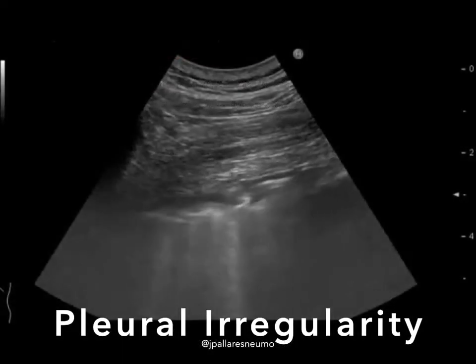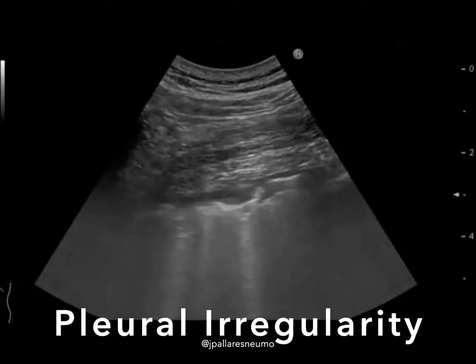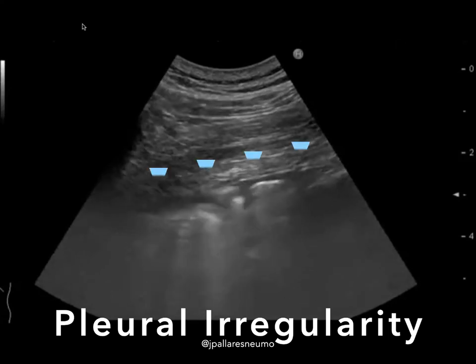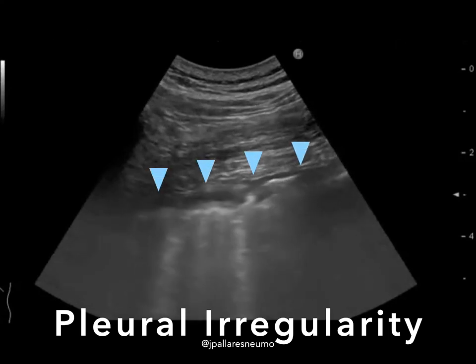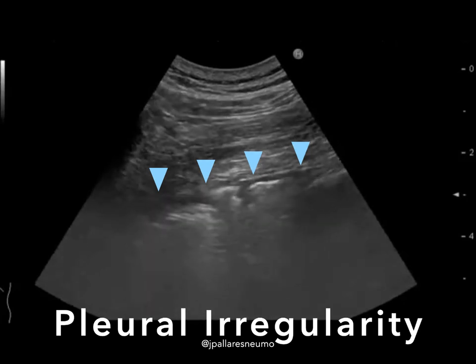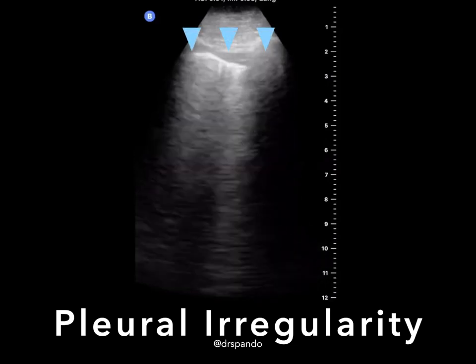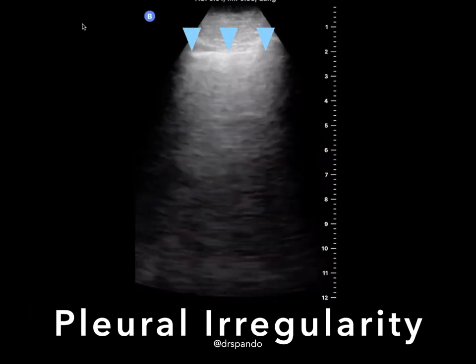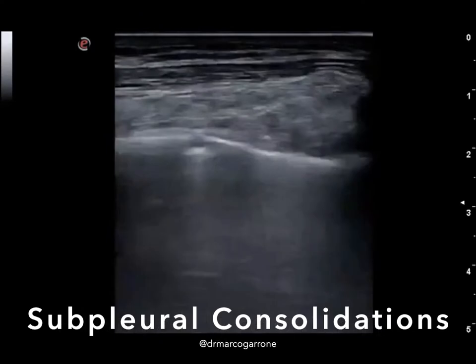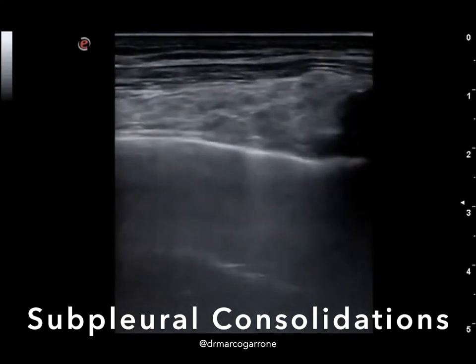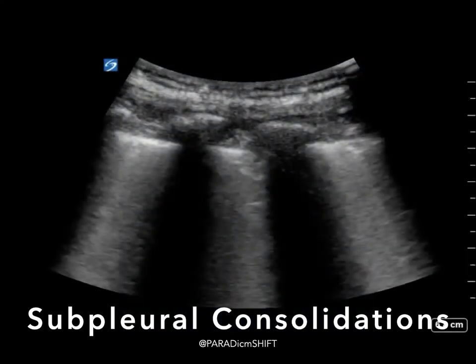Lung ultrasound findings described thus far include abnormalities of the pleura. Patients can get irregularity of the pleural line, as this example demonstrates, or thickening of the pleural line. Here's another clip of pleural irregularity and thickening. Other pleural-based abnormalities include the development of subpleural consolidations, like this example highlighted in orange, or this example of a slightly larger subpleural consolidation.